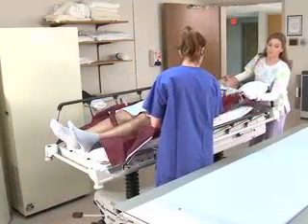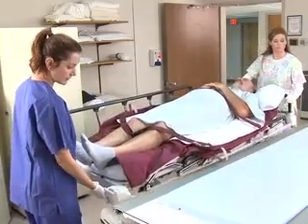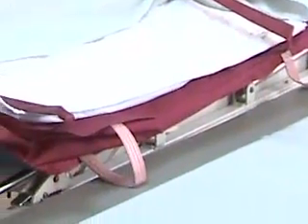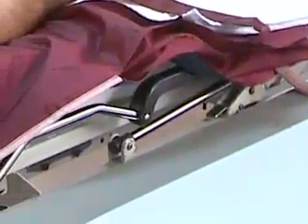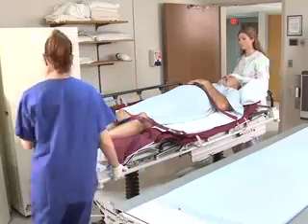Lower the rail of the stretcher nearest to the imaging table and ensure that the HoverMatt is not caught between the mattress and the rail in the process. Move the stretcher as close as possible to the receiving surface. If there is a very wide gap between the surfaces or their heights are very uneven, you may use HoverTech's transfer bridge or a full-length slide board to span the gap. In this case, we are able to transfer without the aid of a bridge.